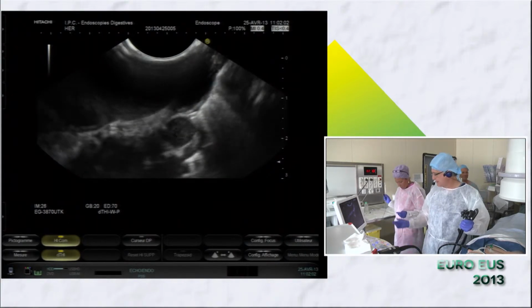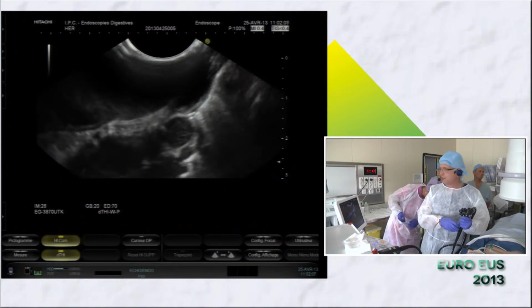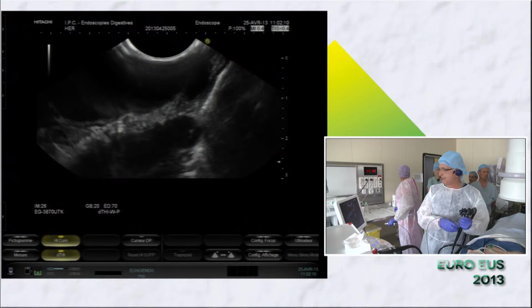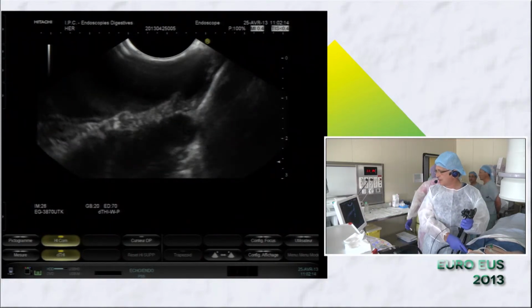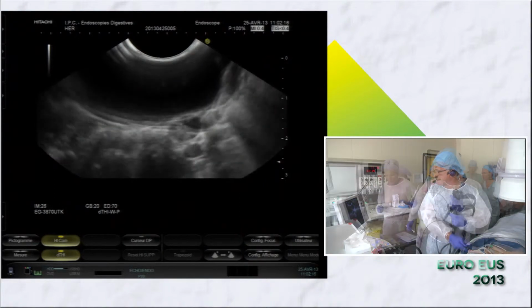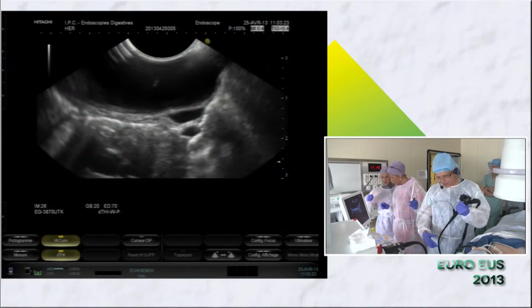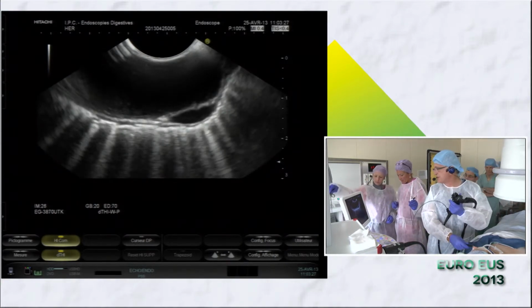We are in pure cut. For this puncture, of course, we need fluoroscopic guidance. I think it's always a good safety to have this fluoroscopic guidance. You see that it's always a little bit more comfortable when you have the scope in a straight position like that.